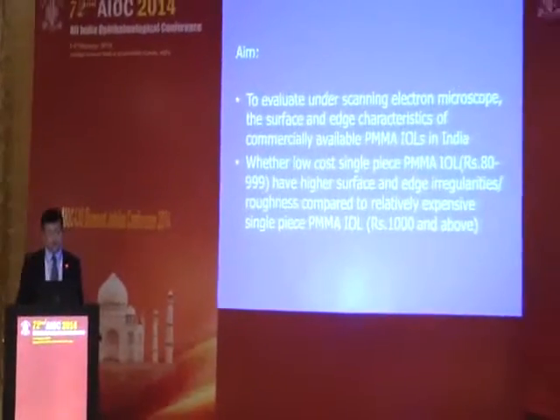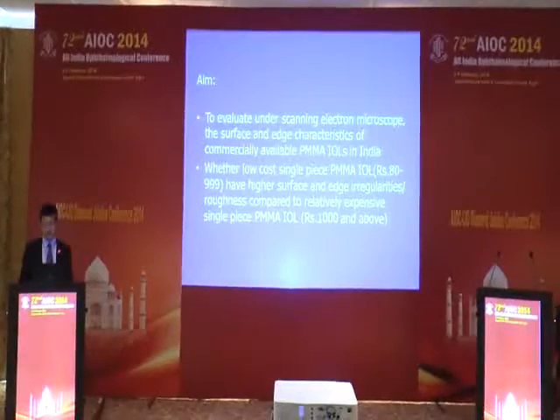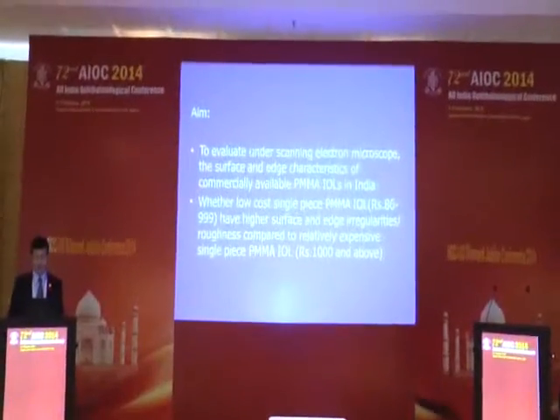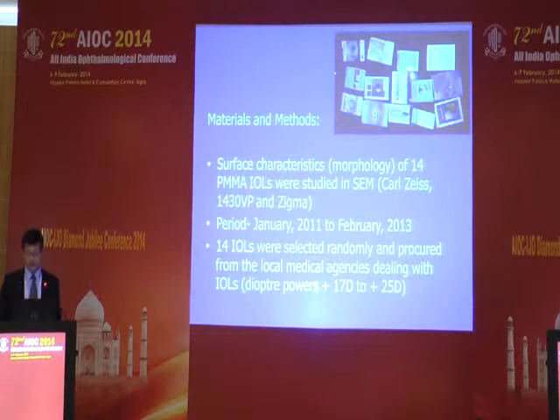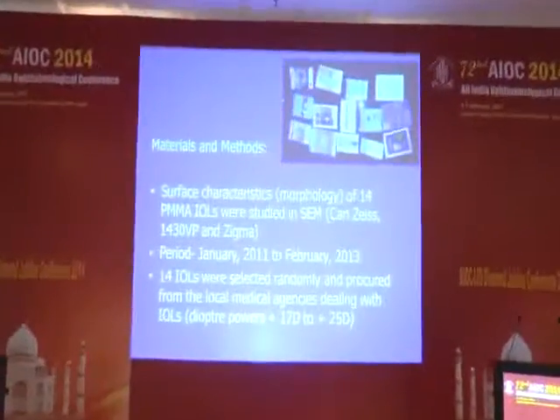In this background, we wanted to evaluate under scanning electron microscopy the surface and edge characteristics of commercially available PMMA IOLs in India, and to see whether low-cost single-piece PMMA IOLs have higher surface and edge irregularities compared to relatively expensive single-piece PMMA IOLs, that is Rs 1,000 and above. We have studied the surface characteristics, that is morphology, of 14 PMMA IOLs in SEM produced by Carl Zeiss company. Period was from January 2011 to February 2013. 14 IOLs were selected randomly and procured from the local medical agencies dealing with IOLs.